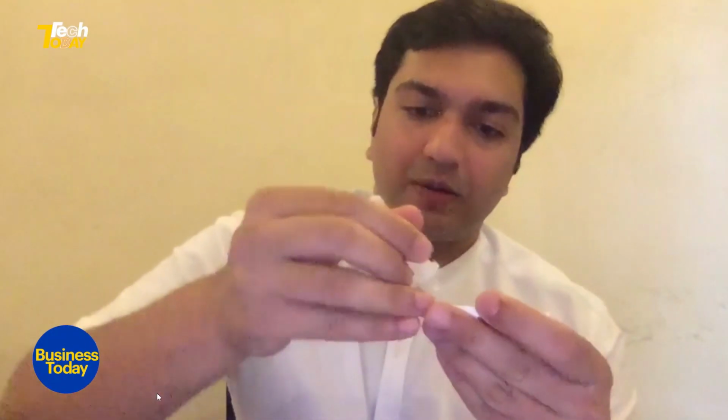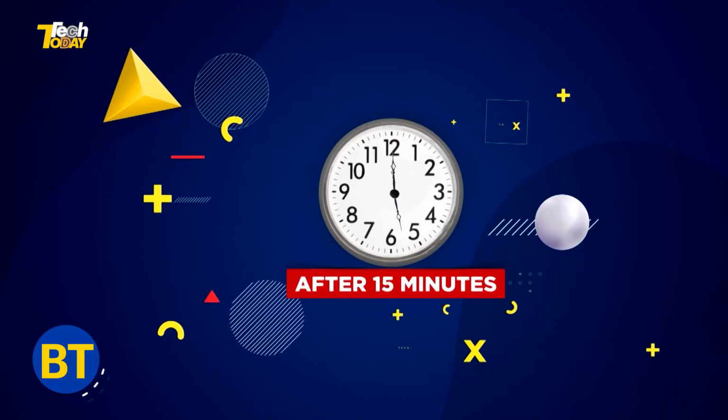Then while withdrawing the swab, I'm going to pinch this plastic tube. So I'm going to squeeze the swab. Now don't remove the swab completely. Just break the swab. Put the dropper on. So you see this little well here? I'm going to put 4 drops into that well. Okay, so I've put 4 drops into this. And now we wait for 15 minutes.